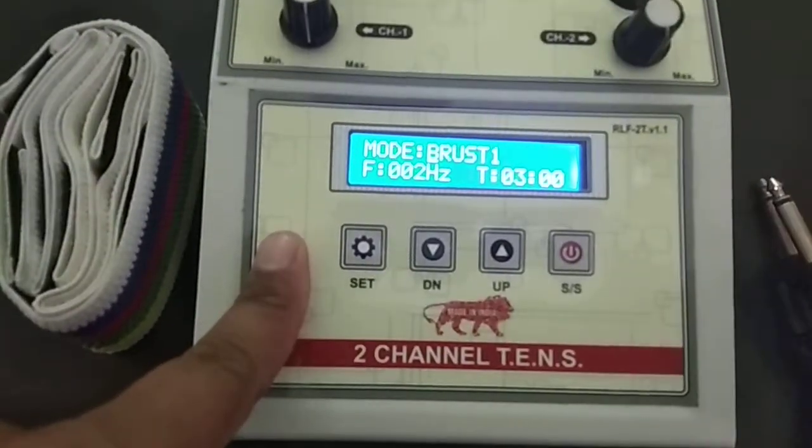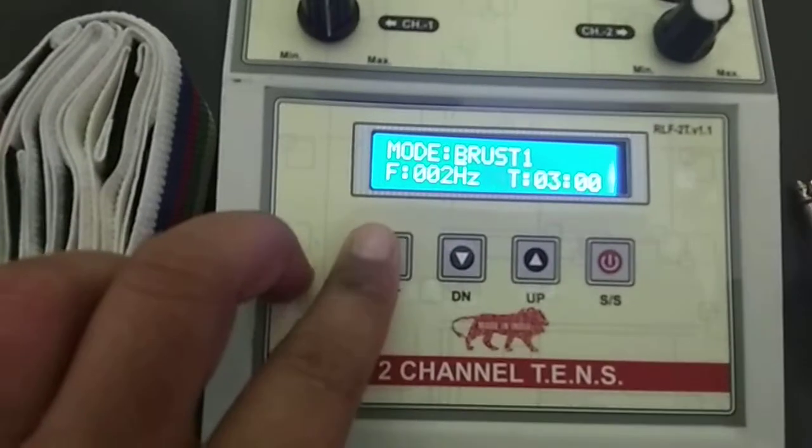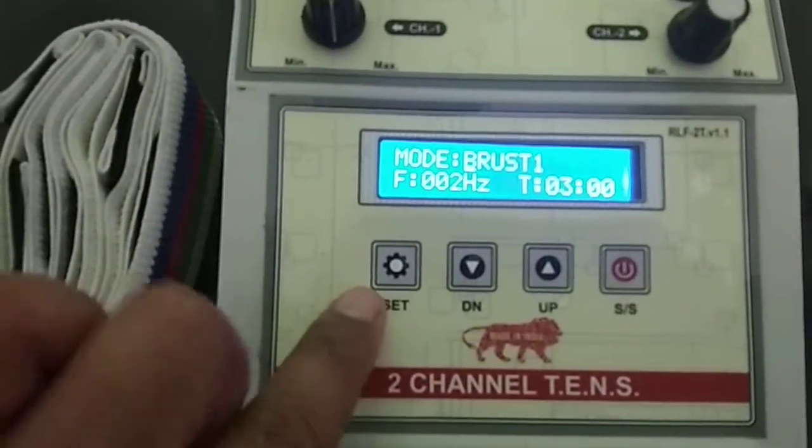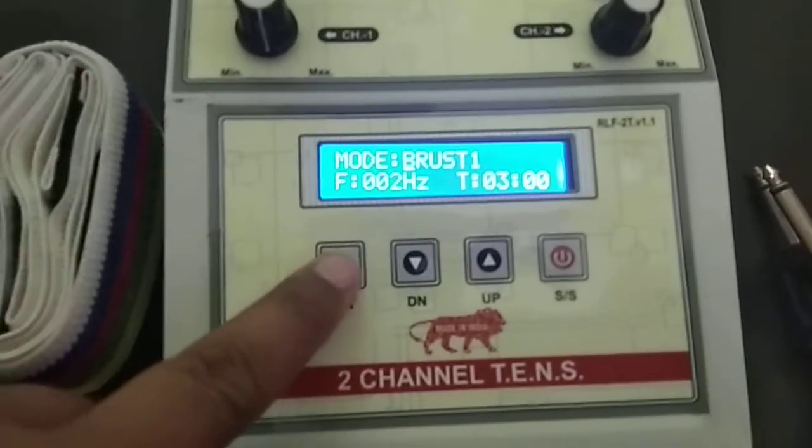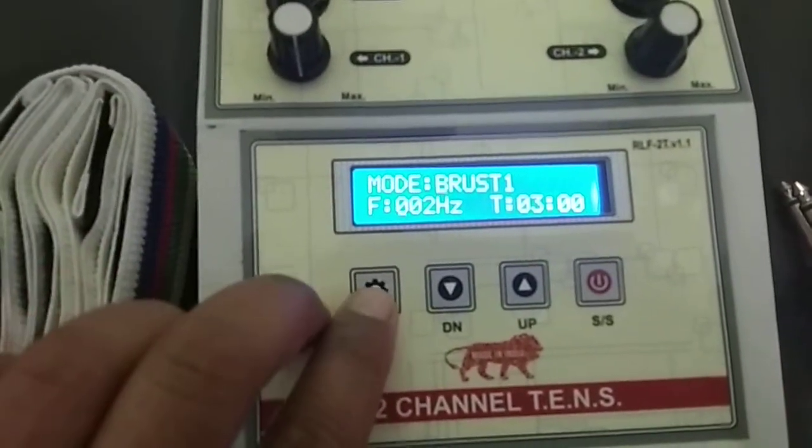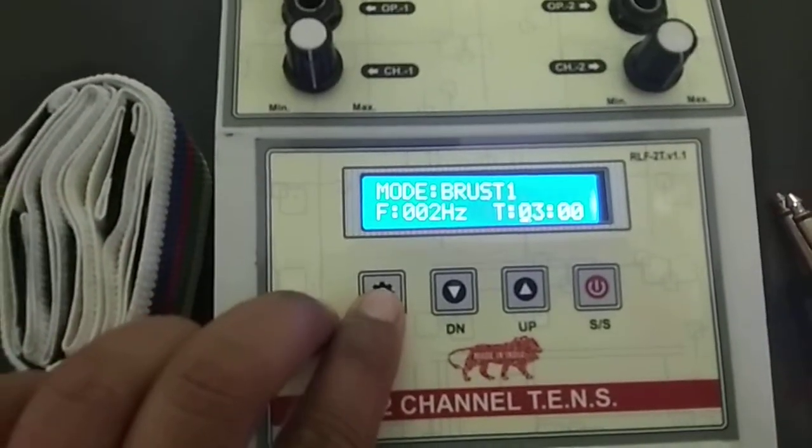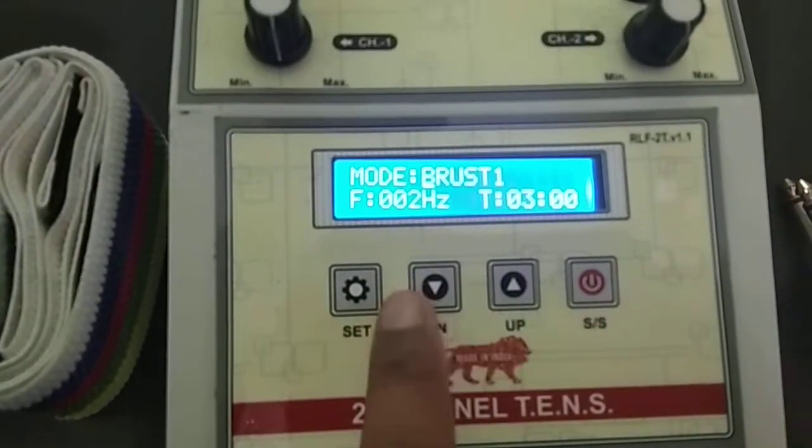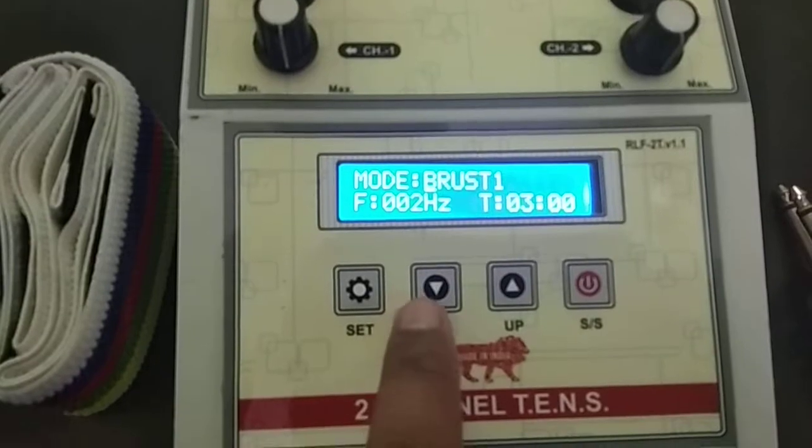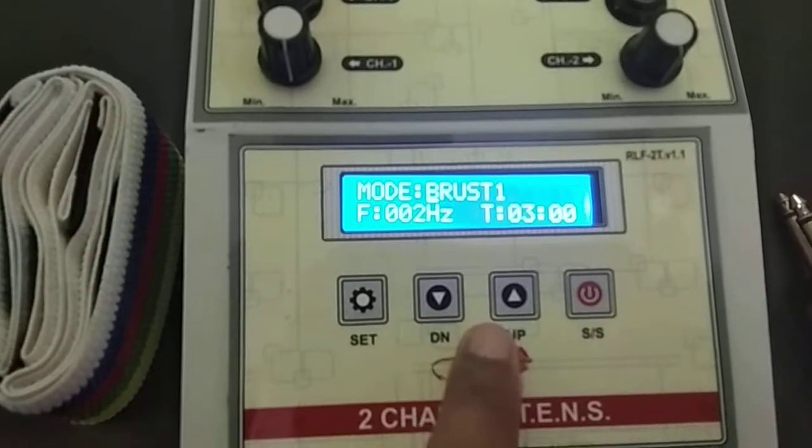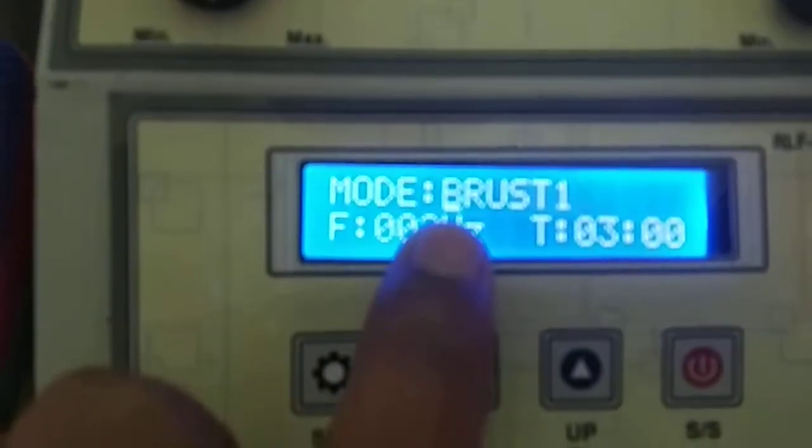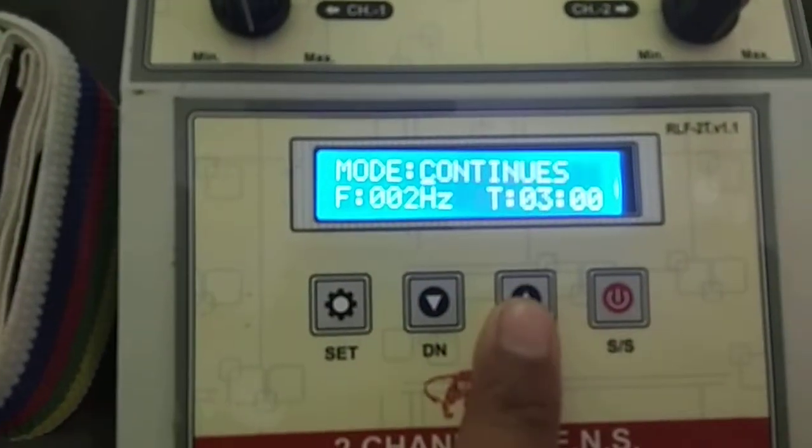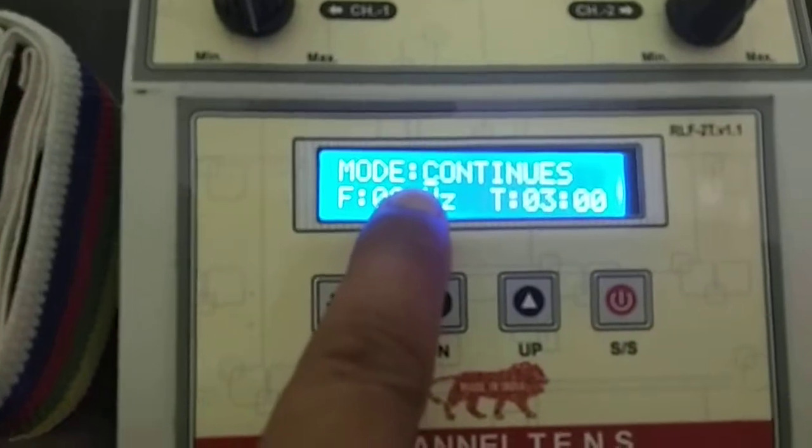For operating any programs, first of all you have to choose the mode by pressing setting key. And when the cursor is on content, then you can select by pressing these two keys. Now the cursor is on burst 1 mode, so I am selecting any one program. I selected continuous.